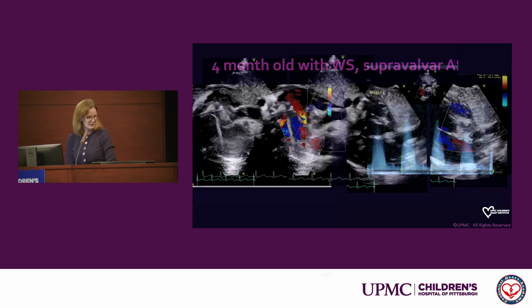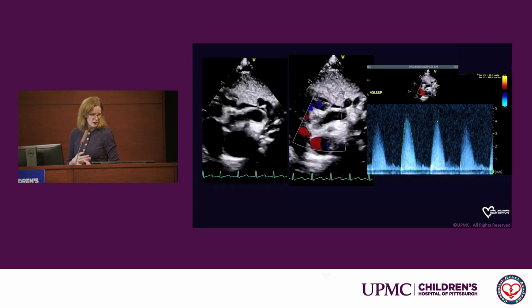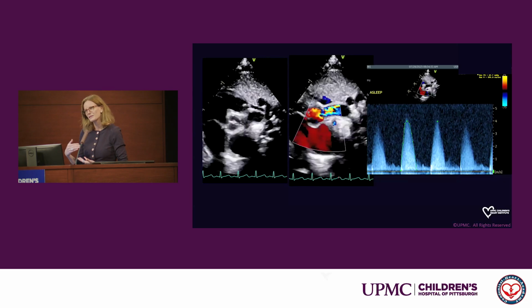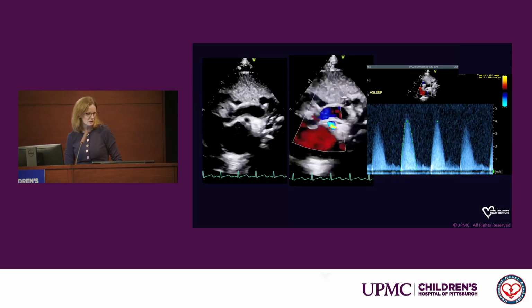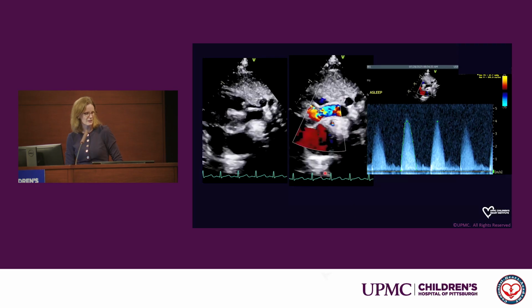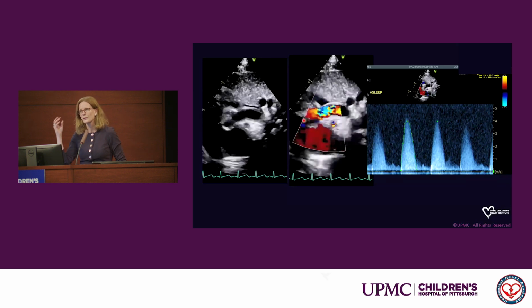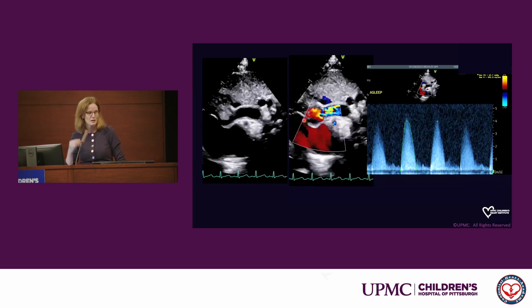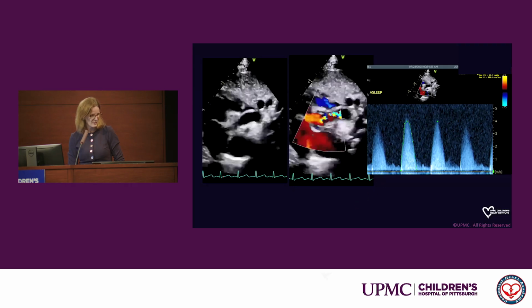And just more transthoracic images, because I think it's good to see what a heart looks like on echo, and then I'll show you what it looks like on CT. So again, the sonographer has now moved up almost into the suprasternal notch area. You can see this very well-formed aortic valve, very well-formed aortic root, and then all of the pathology at the STJ with severe gradient.